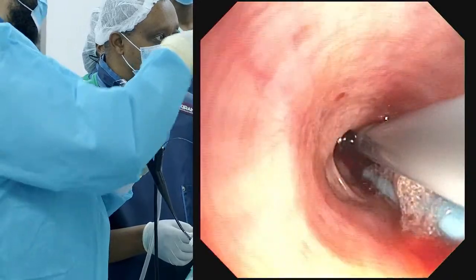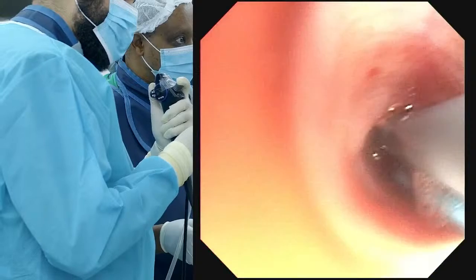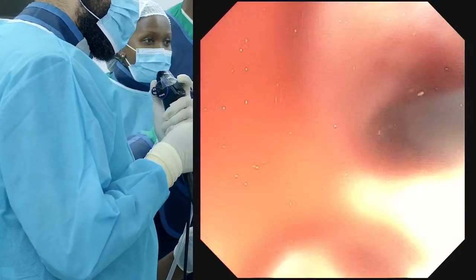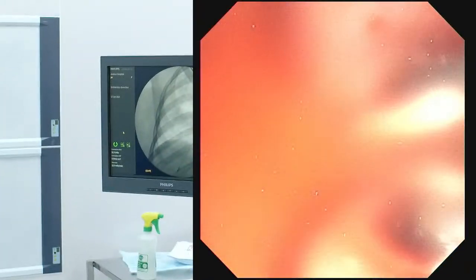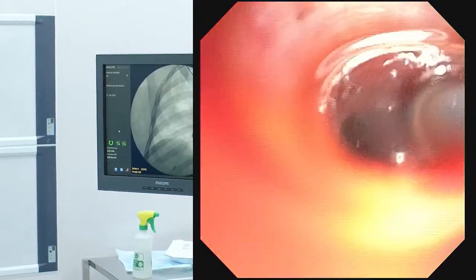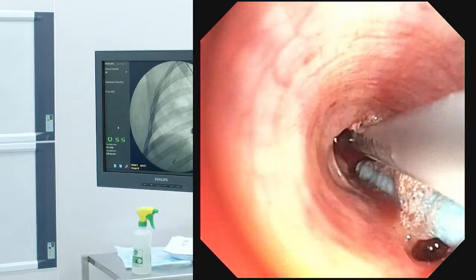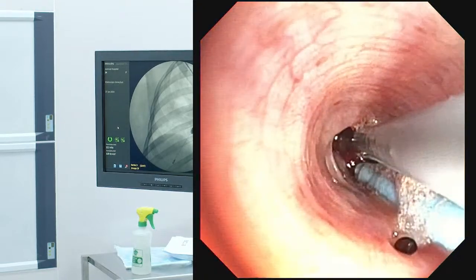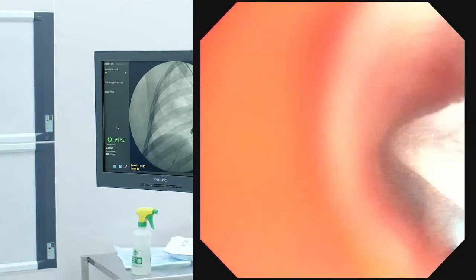As soon as the probe is out, even if my vision is not so good, I just use the fluoroscopy to see where I'm going now. You can see on the fluoro we're again posterior, so I'm going to come back out maybe 2 centimeters. You can even recheck it here, see? But that's okay. Then we can 2, 3, 4, and 5.